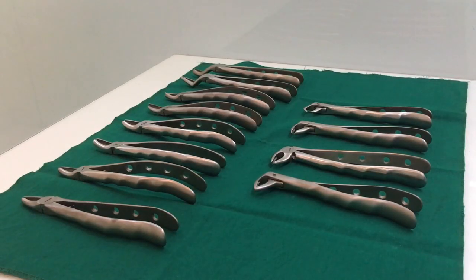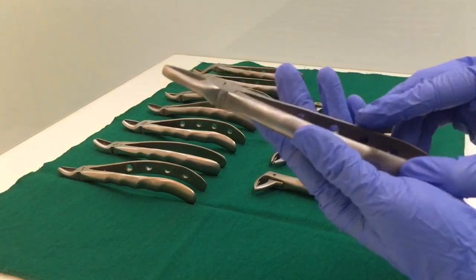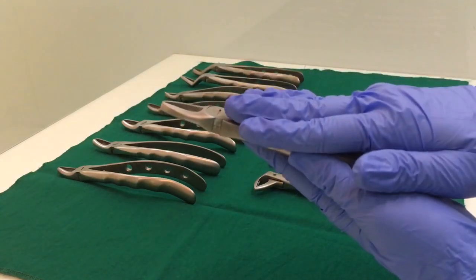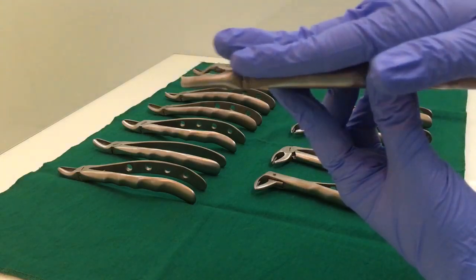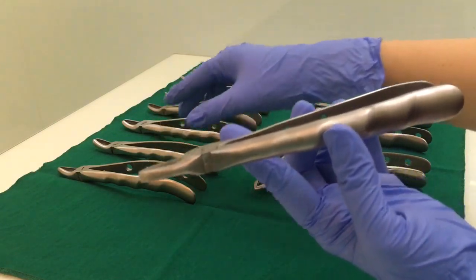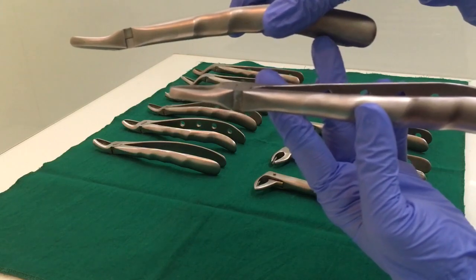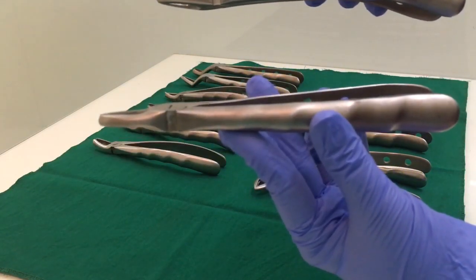We will learn about the upper forceps. This one right here is the upper anterior forcep. The major difference is that the handle is straight, whereas all the other upper extraction forceps will have an angulated, curved handle. This is curved and this one is straight.